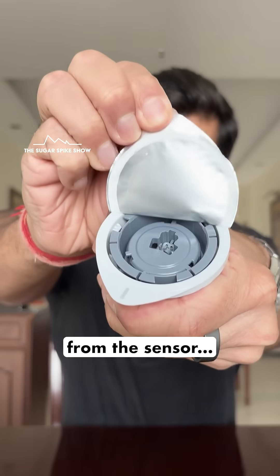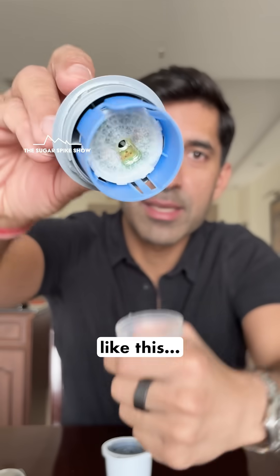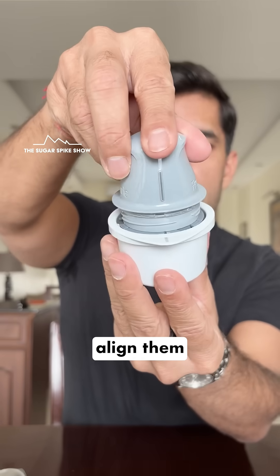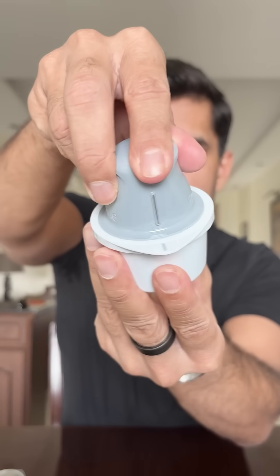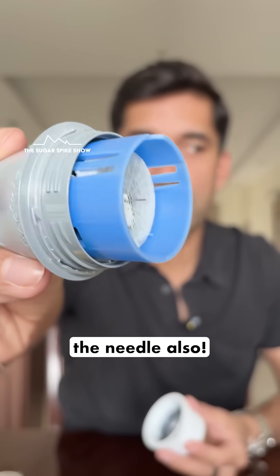First, you can peel off the sticker from the sensor — this is what it looks like. Then you can open the applicator like this. You take this line and this gray line here, align them perfectly and punch it in. Now the sensor is stuck to the applicator and you can see the needle also.